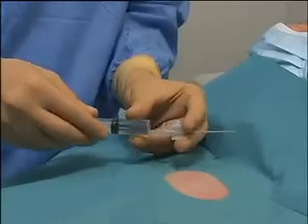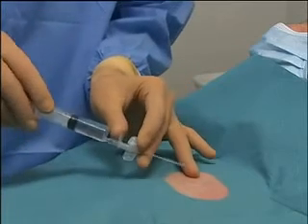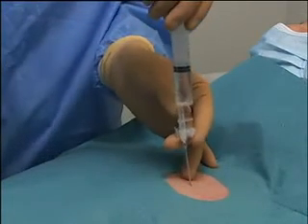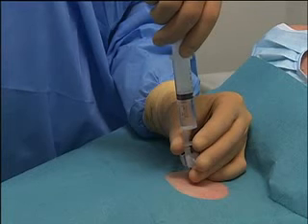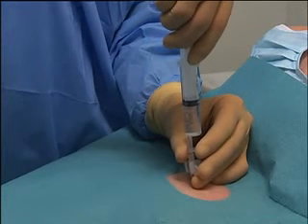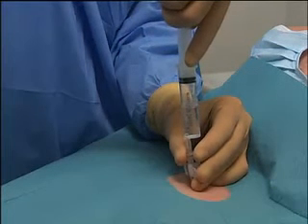Connect the over-the-needle catheter to the 10 ml lidocaine syringe, which should be partially filled with the remainder of the local anesthetic. Stabilize the skin with the non-dominant hand and puncture the skin with the catheter using the same landmarks that you used for the local anesthetic. Continue to aspirate with the syringe, slowly progressing in the direction of the pleural space. Again, when the needle penetrates the pleural space, air bubbles will appear in the syringe.